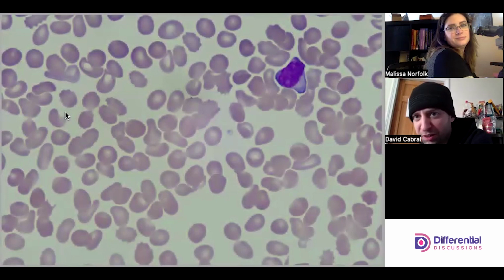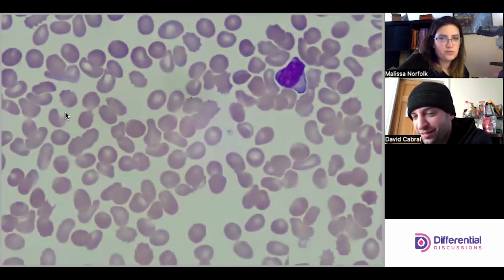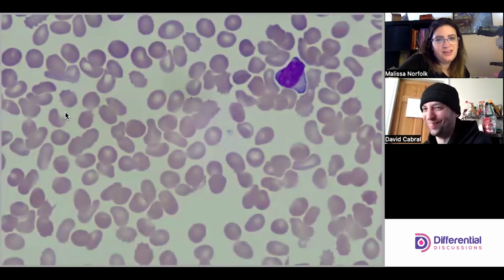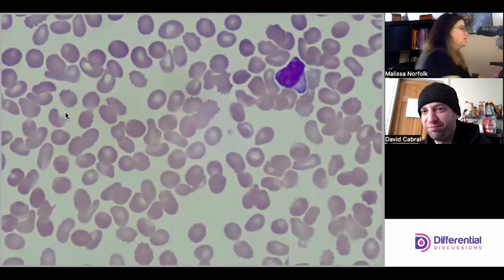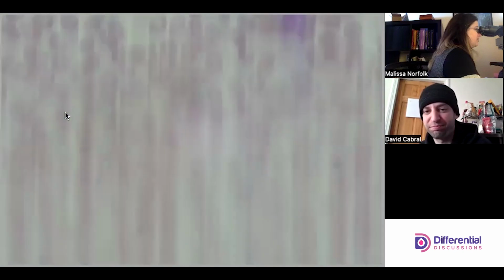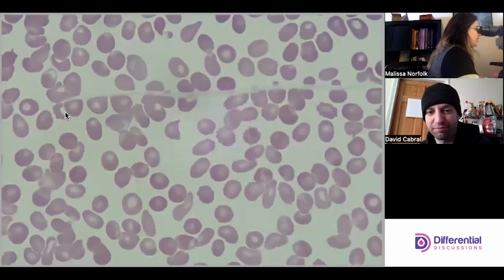It's kind of on the smaller side, I think. No, he's just a lymph. You think it's a lymph? Yeah, he's a weird looking lymph. I honestly don't think he's reactive. I think it's just circumstance. Okay. He looks pretty mad to me. On the record, I think it's just where he's touching, because the red cells are kind of squishing him into this shape. We're at the edge of the slide. See? So I don't believe him. I think he's lying.